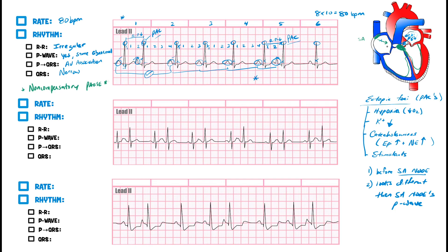PACs can generate a specific rhythm pattern. Looking at this second EKG, let's determine the rate: counting R waves — one through twelve — twelve times ten equals 120 beats per minute, so it's fast. Looking at the R-to-R intervals, there is definite variability, so this is irregular.